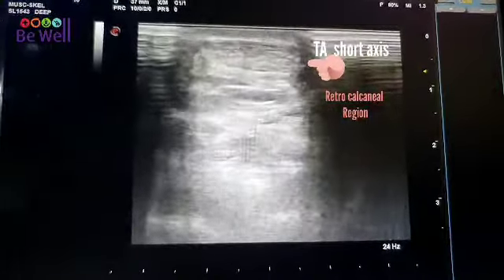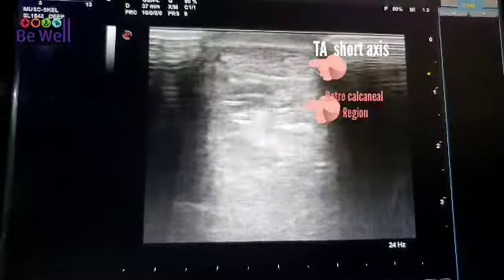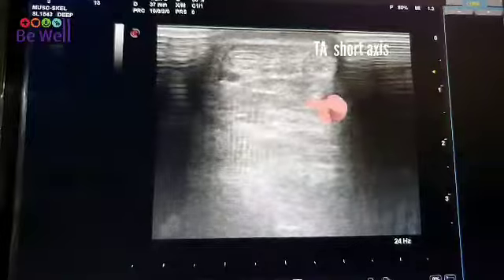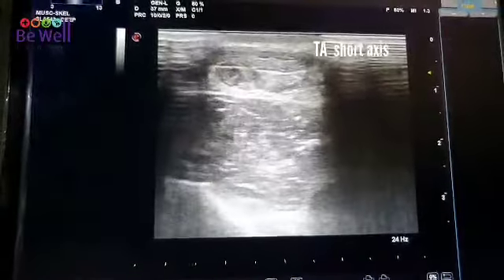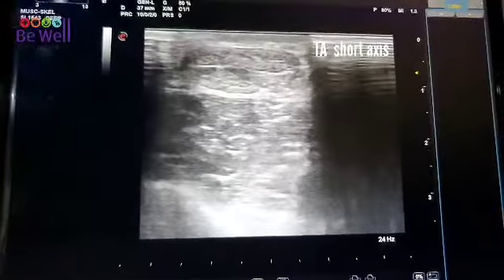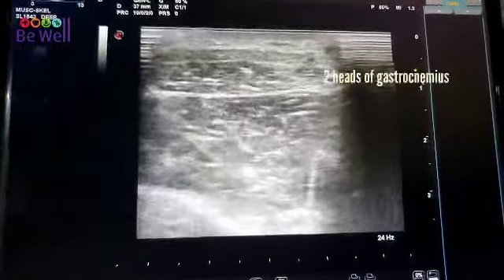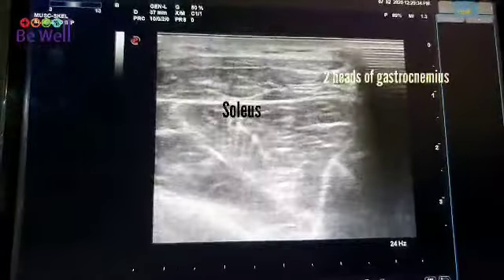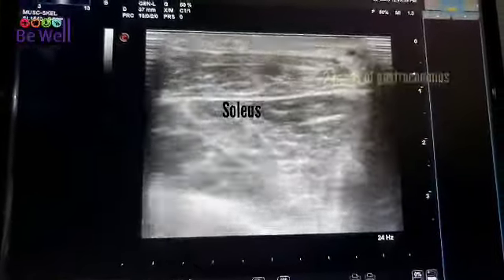As I move on, you can see the tendon thinning. Coming down again — no fluid collection underneath. And as I go up, now you see the tendo Achilles changing into a tendon, going on to the muscle belly. You can see the soleus below and the gastrocnemius on top.